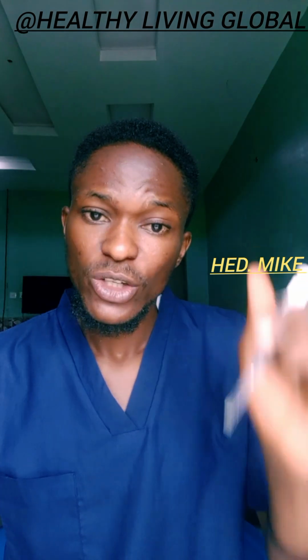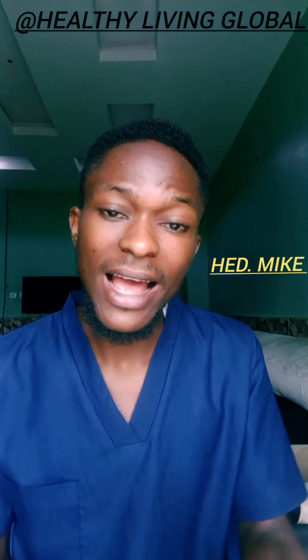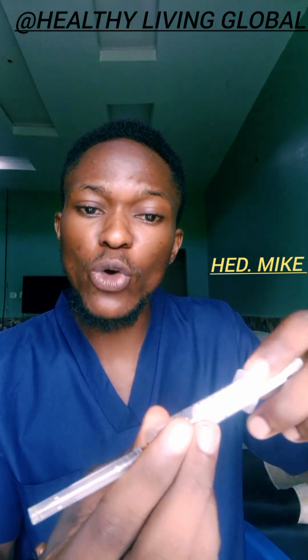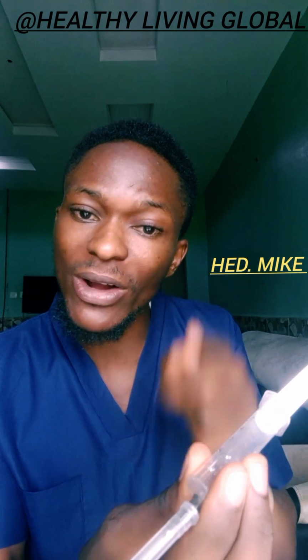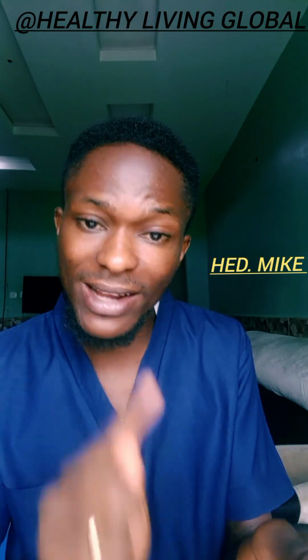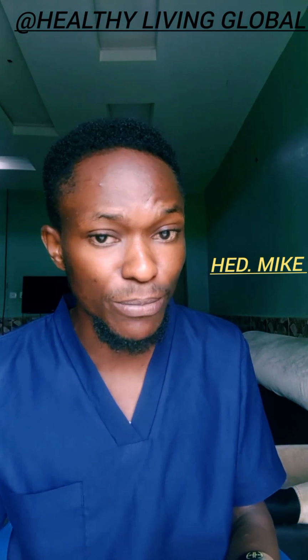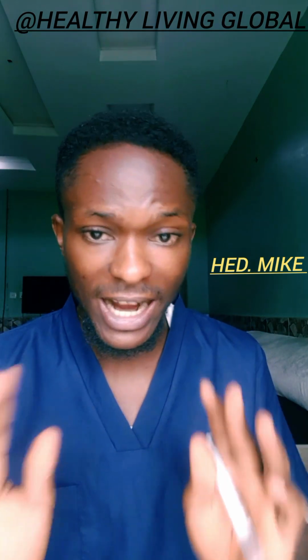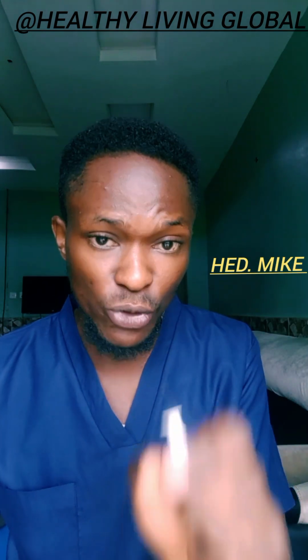When it dries, you now insert your needle and aspirate. Remember, aspiration means you are drawing back the plunger to make sure that it did not enter any blood vessel. You draw it back, you check. If blood enters, remove it, discard it and prepare a new one. It means you put it in the wrong position. If no blood enters, you are in the right position, especially if you use this particular position which I gave you in this video.